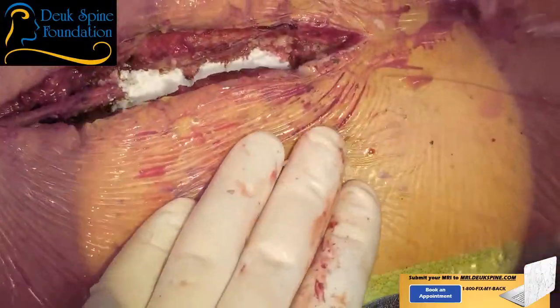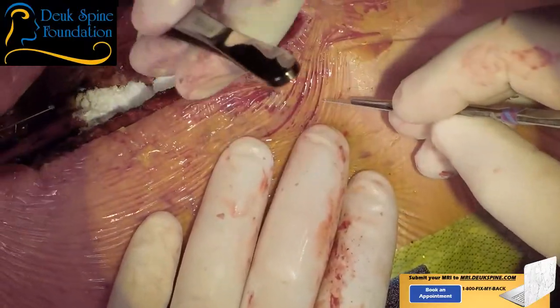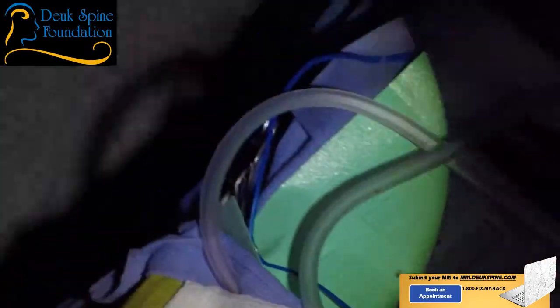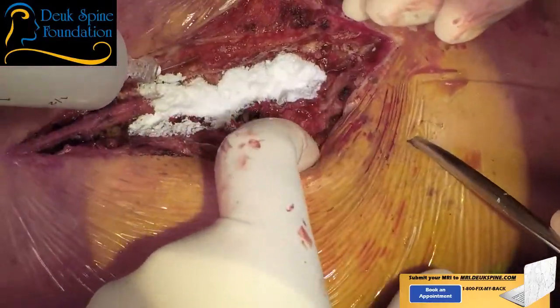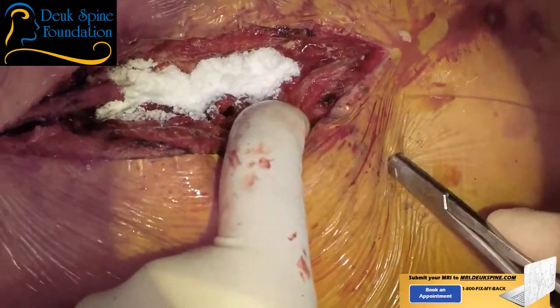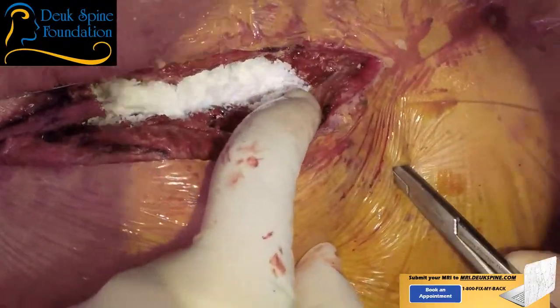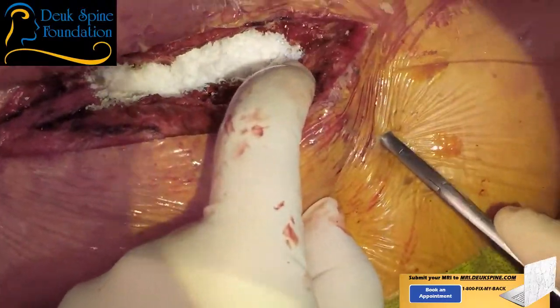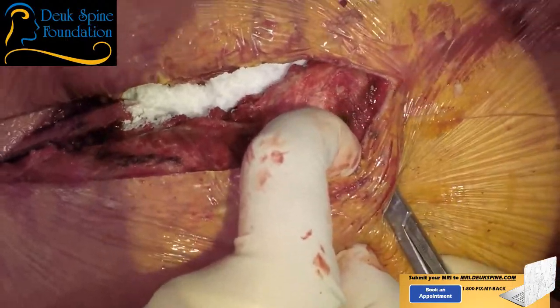And one of the things about these, thank God it closes, you worry about is, put the drain off to the side, always at the bottom. I have to go through the fascia. One of the things you worry about is, can you bring the edges together? You don't want to puncture the spinal cord, so you want to aim under the fascia. Unfortunately, there's all that scar tissue. Because you want to come in the muscle. Do you have a smaller hemostat, a mosquito? I may be able to get it if you don't. It's just so much scar tissue.